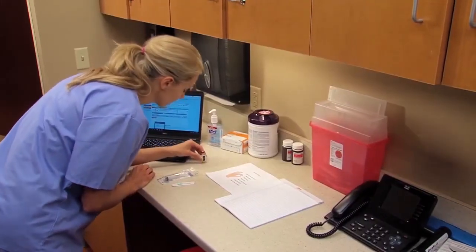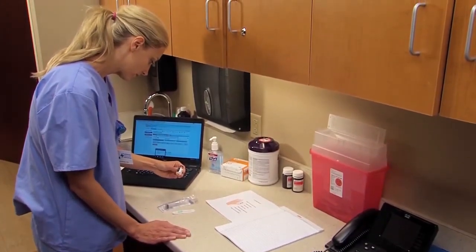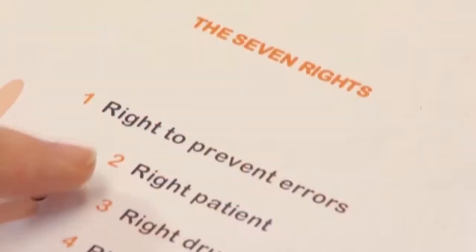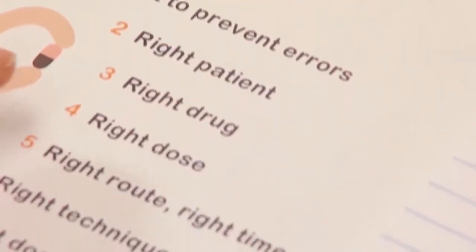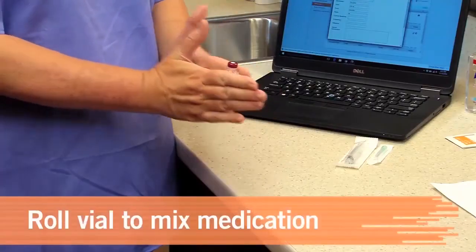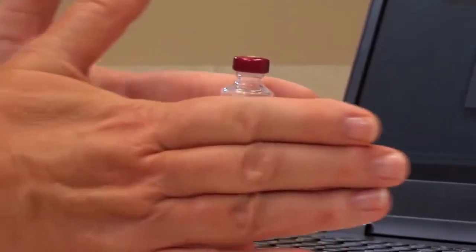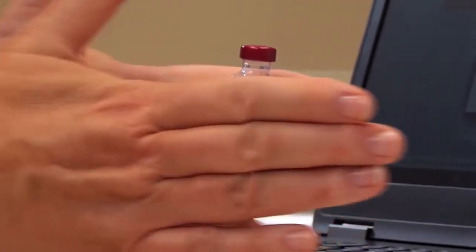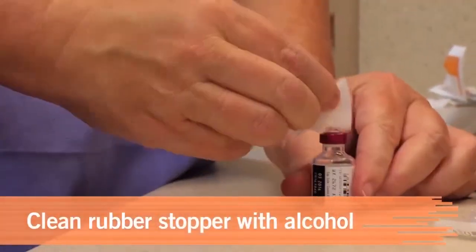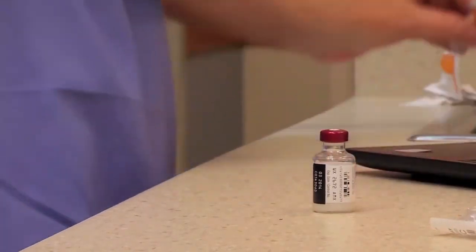Compare the order with the label on the medication vial once more just before dispensing the ordered dose. Make sure that the strength on the label matches the order and that you dispense the right dose by the right route at the right time. To mix any medication that may have settled, gently roll the vial between your palms. Don't shake the vial, since that may create air bubbles in the medication. Using a circular motion, clean the rubber stopper with an alcohol wipe. Place the vial on a secure, flat surface.